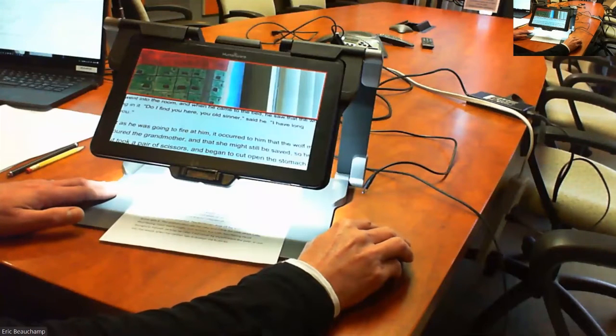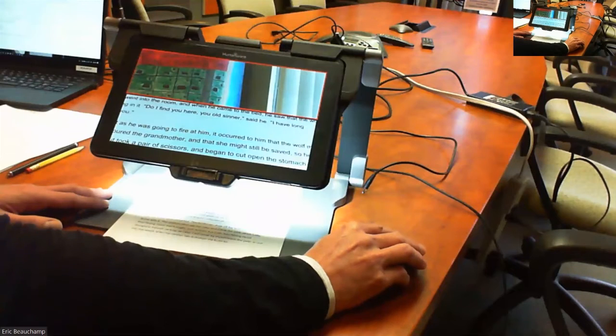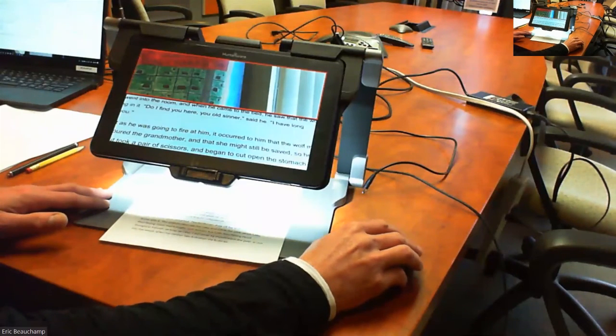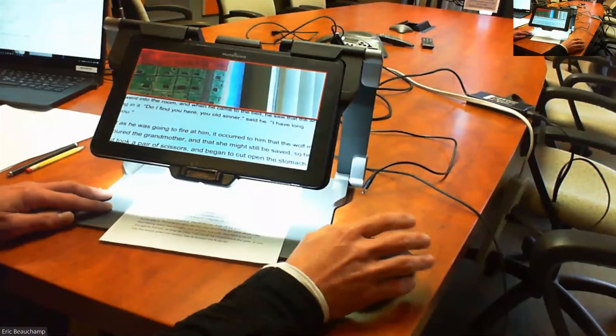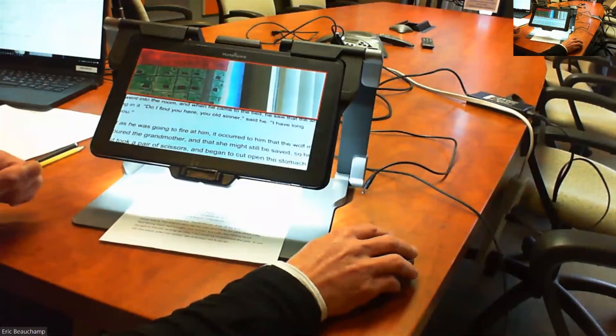So can you save an enlarged image from either the magnifier or the distance camera? Yes, we just went through it. You can capture distance images by pressing and holding your finger on the screen. That's no problem.